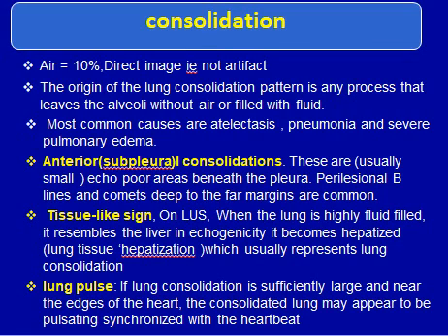So what's the consolidation? Consolidation has only a little air, 10%. That is the image, it's not artifact. The origin of the lung consolidation pattern is any process that leaves the alveoli without air or filled with fluid. Most common causes are atelectasis, pneumonia, and severe pulmonary edema.